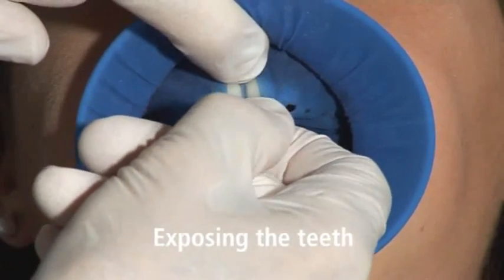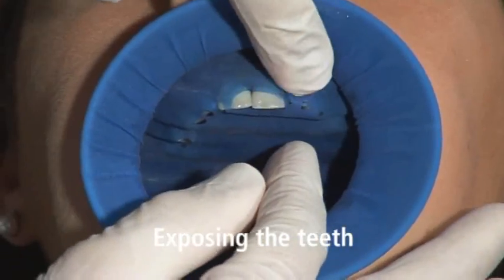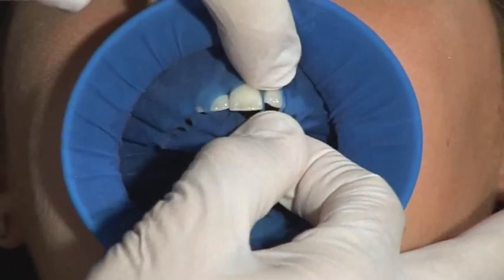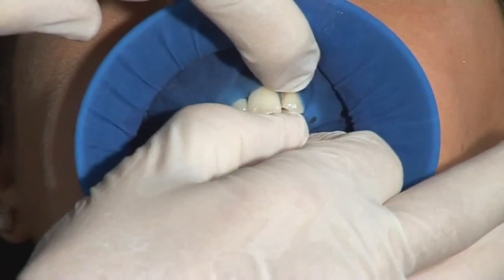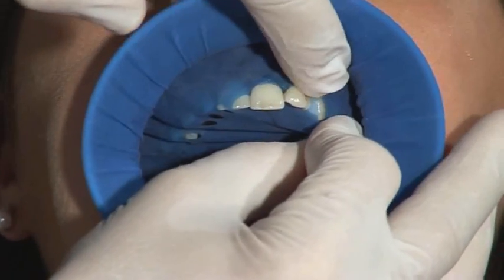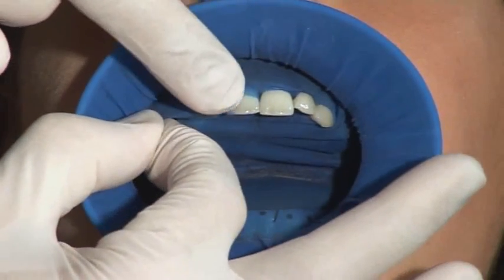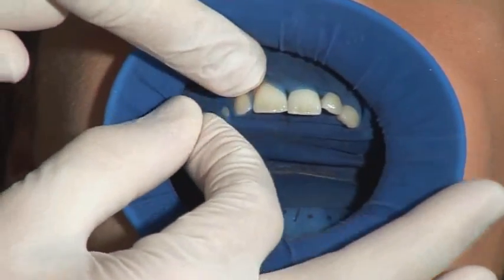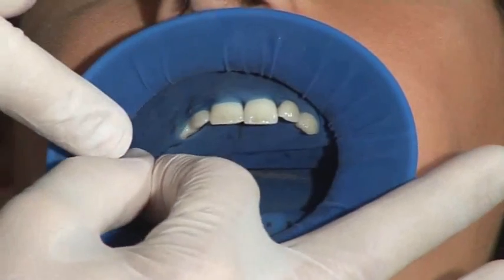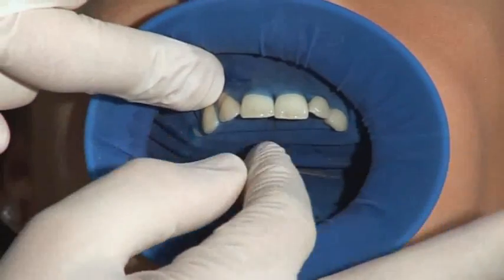To isolate the individual teeth, slip the interdental septa of the Optredam through the contact points between the teeth, initially without the aid of dental floss. This is much easier than trying to put the holes over the individual teeth. To simplify the process, slightly pull the septa with the index finger in the direction of the fold and hold it at cervical level. Using the other hand, pull the septa in a lingual direction and through the contact point. Thanks to the three-dimensional shape of the Optredam, it automatically stays in position in most cases without additional stabilization elements.